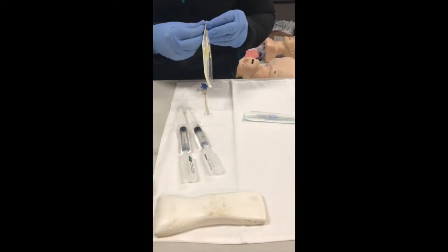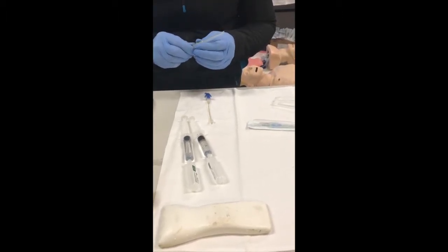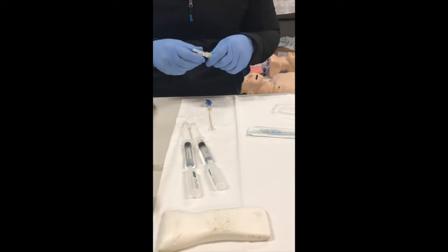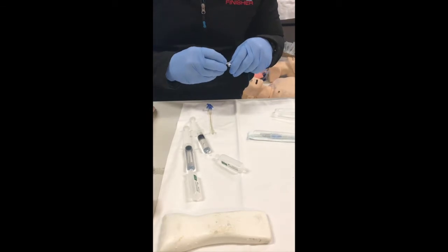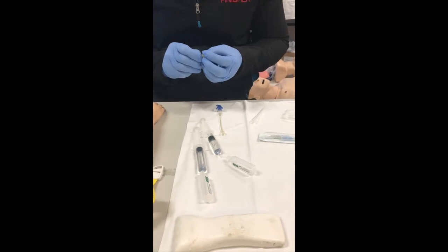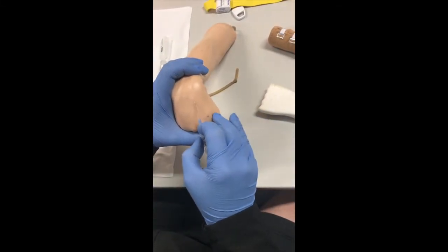What I'm doing here, as it can be difficult when placing an IV into a small child because of their small veins to get reasonable flashback, I am flushing the cannula with some normal saline, so when I get that tiny little bit of flashback, the blood will dilute into the normal saline within the cannula, and this can show me that I'm within the vein. For small infants, a tourniquet isn't required, and I can utilise this technique for IV cannulation.